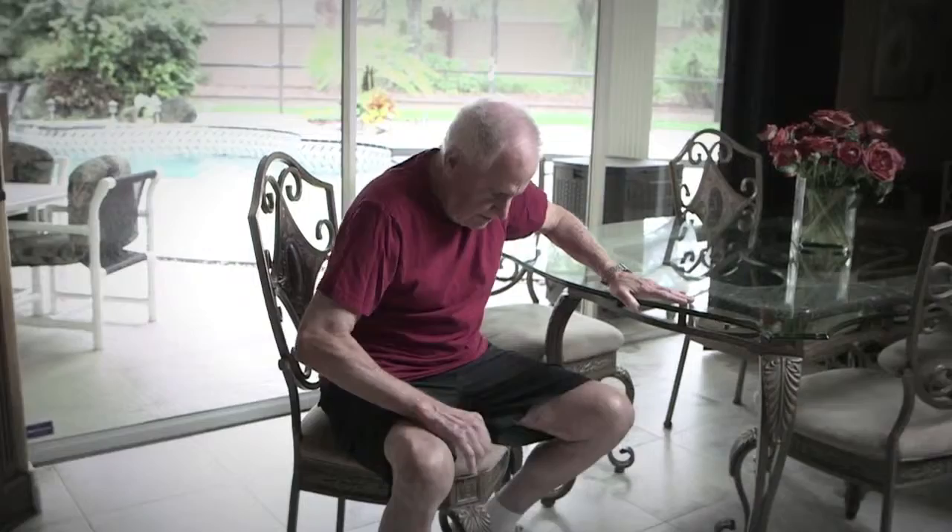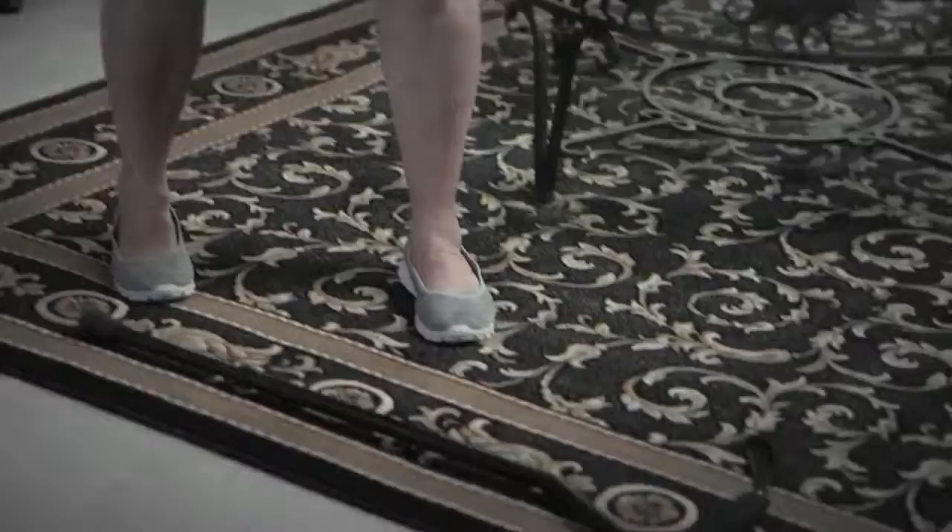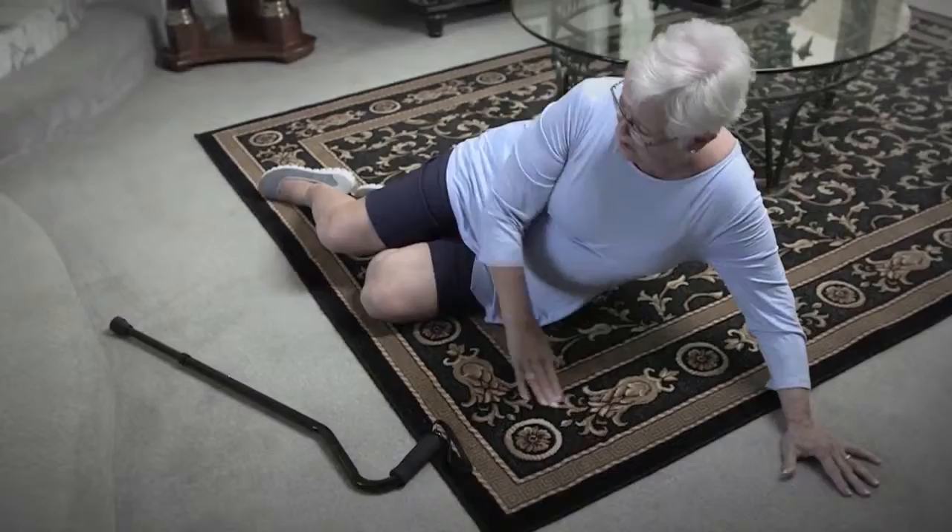Feeling a bit unsteady on your feet? Having moments where the simple task of getting up from your chair becomes a struggle? Relying on others for help can take away your independence and confidence. If you rely on a regular cane, they can slip and slide and offer little to no support. And when your cane falls, how do you pick it up without endangering yourself?